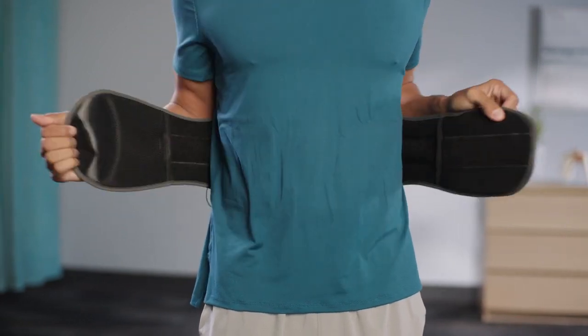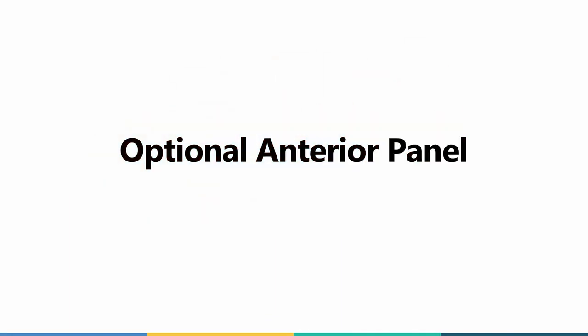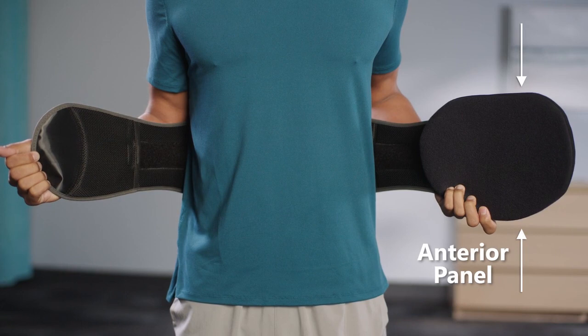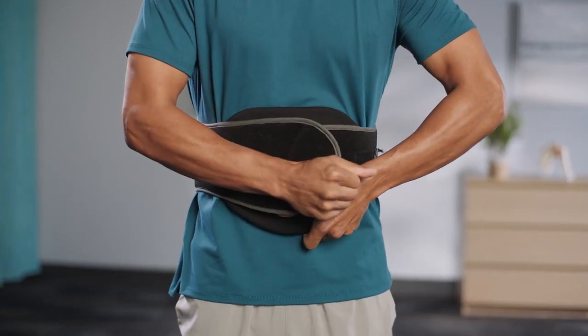Detach the hook and loop at the front to remove the brace. All Essentials lumbar braces include an optional anterior panel. This panel can be used for additional anterior support.